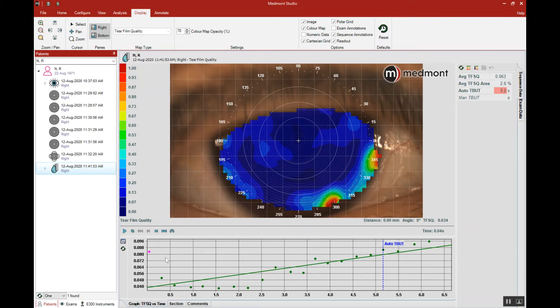On the graph below, we can observe how the patient's tear film moves towards stabilization after the blink. The zero along the y-axis represents the beginning of the test, when the instrument recognizes the second blink. The tear film is relatively stable for about two seconds, then begins to destabilize, reaching a tear film breakup time of 5.2 seconds.